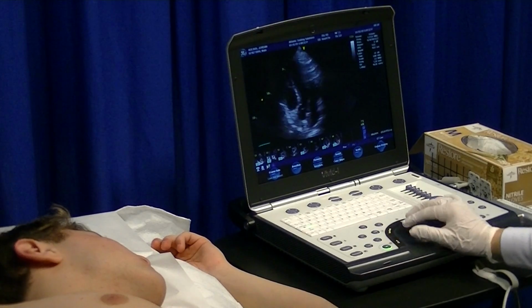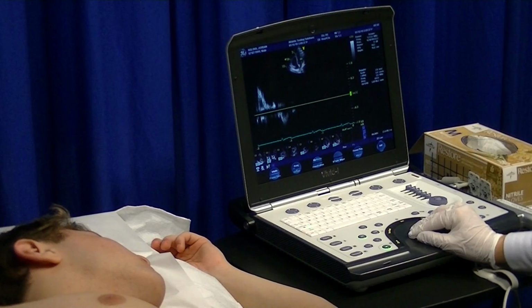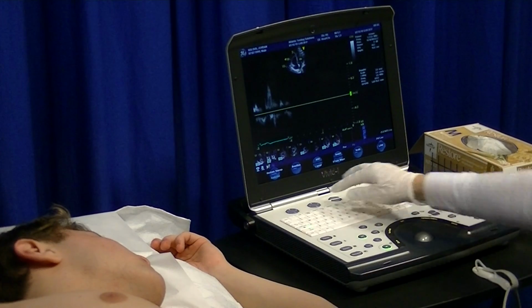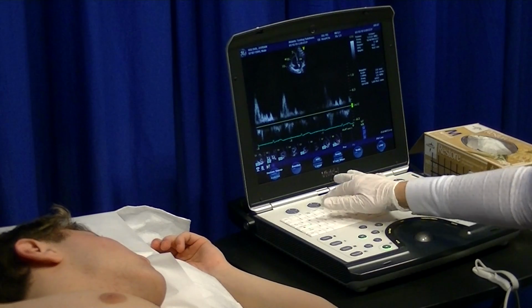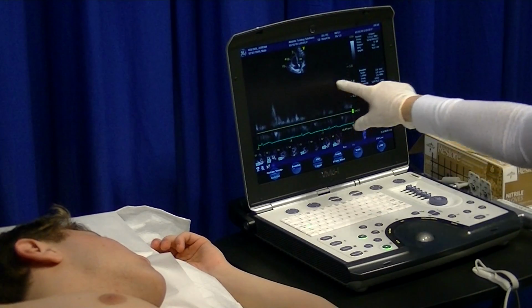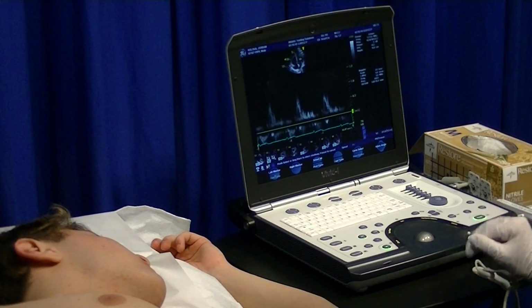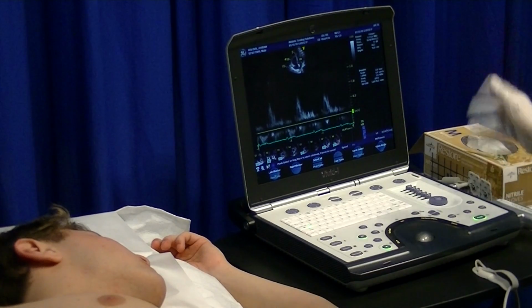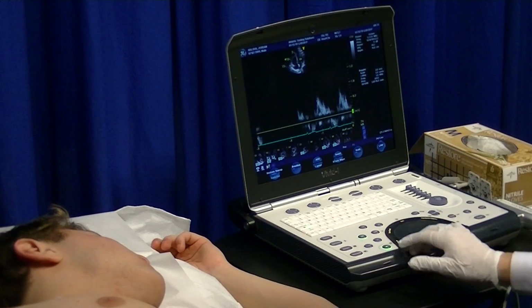Next, we're going to pulse our mitral valve inflow. For Doppler studies, I like you to use the 2/3 rule, filling about 2/3 of your Doppler screen here. And you're just going to obtain approximately 3 beats across there and store it. We do not need to measure the velocities.